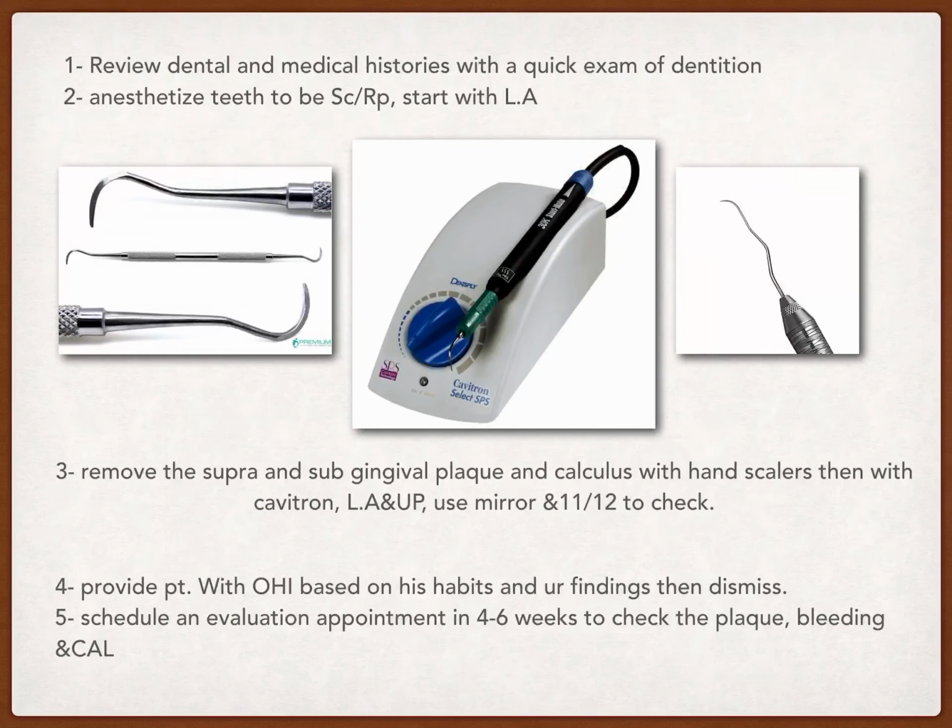And after doing the diagnostic procedure, we will anesthetize the teeth to be scaled and root planed, and it is advised here to start with the lower anterior teeth so that your back muscles will stretch and adapt to the procedure, because the procedure may take a long time.